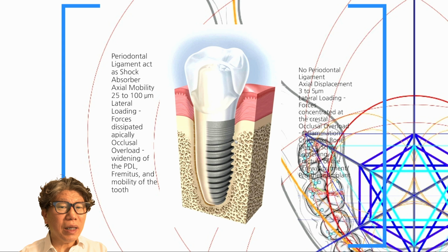So, when looking at most papers, the most promising material for implants is what is referred to as inert material, which does not rust. It's not affected by rust, so inert material is highly recommended. In the past, attempts were made with aluminum, then silver, and implants were made using various metals. But recently it has almost universally moved to titanium, and implants with HA coating on titanium are now predominantly used.